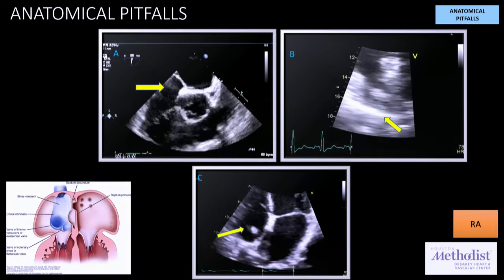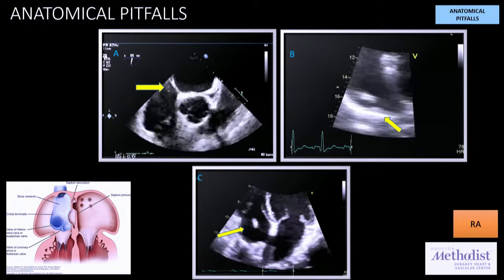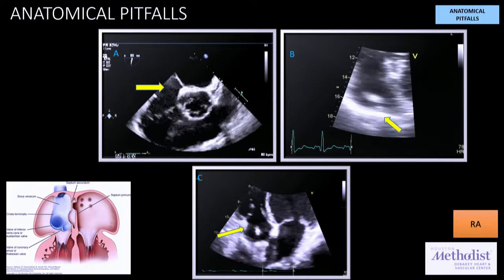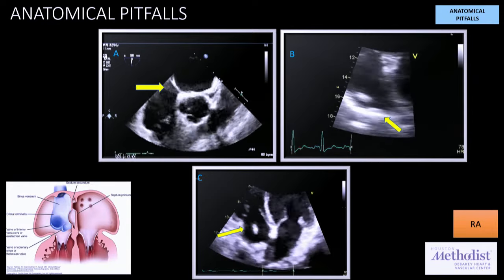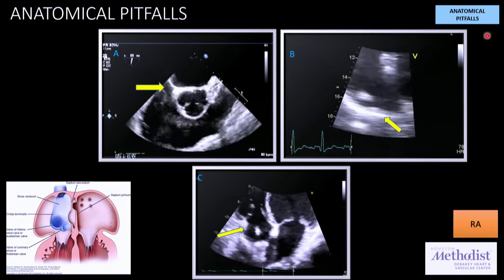And the last one, again, we see it very often. It's just either a pacing wire, sometimes you do see catheters in patients as well. All right. I think we have to repeat Salim again. I mean, on B, can you tell?